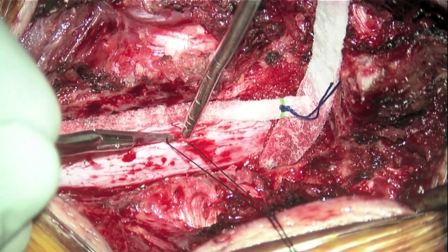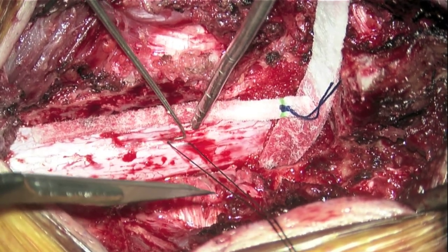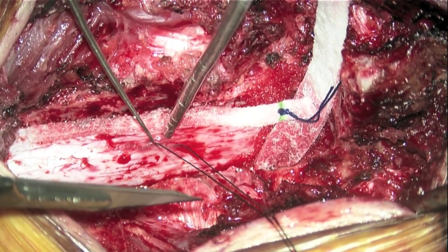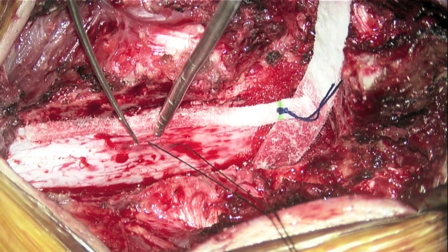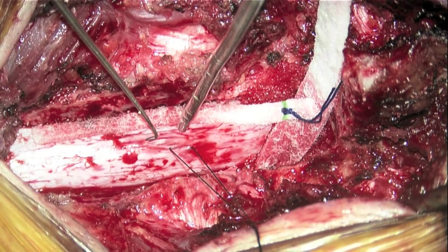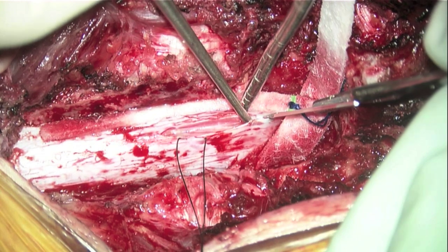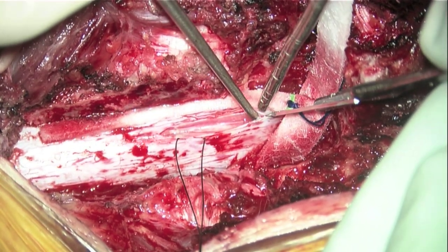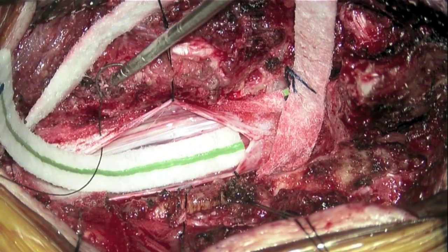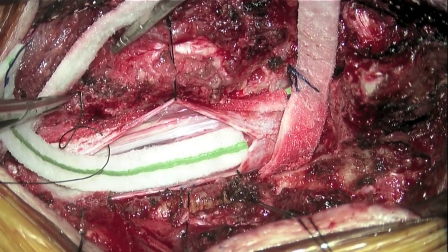The dura is opened in the midline with preservation of the arachnoid to avoid excessive CSF drainage or dorsal displacement of the cauda equina nerve roots through the dural incision. The dura is sutured laterally to the paraspinal muscles to maximize intradural exposure and reduce epidural bleeding.